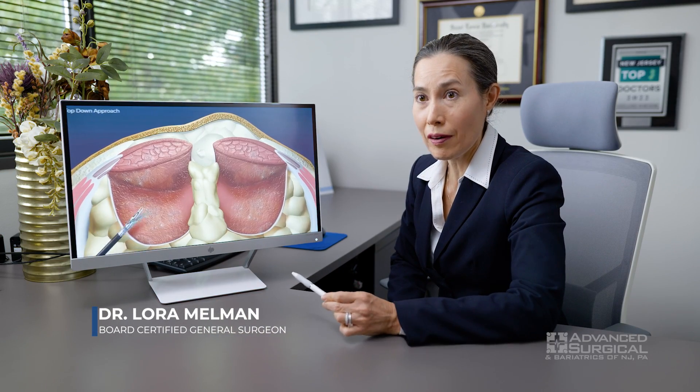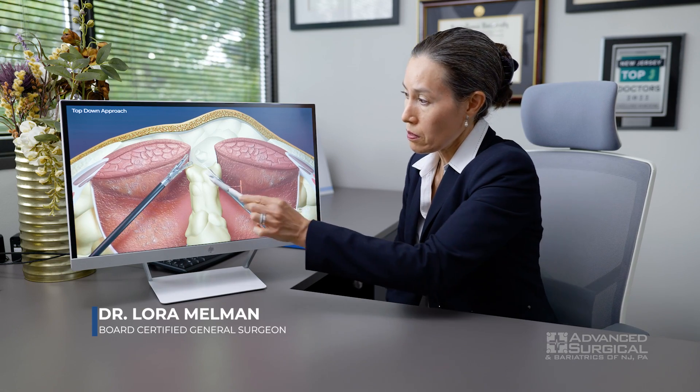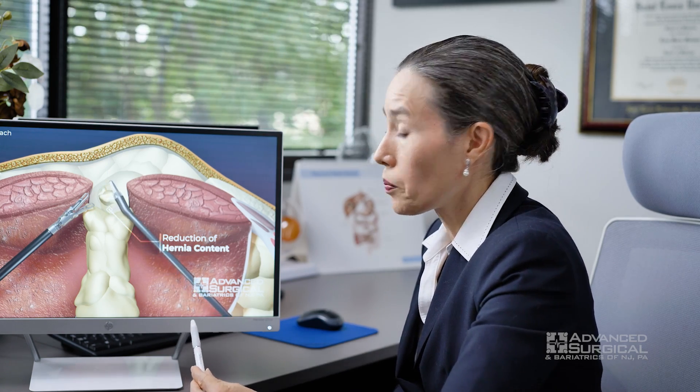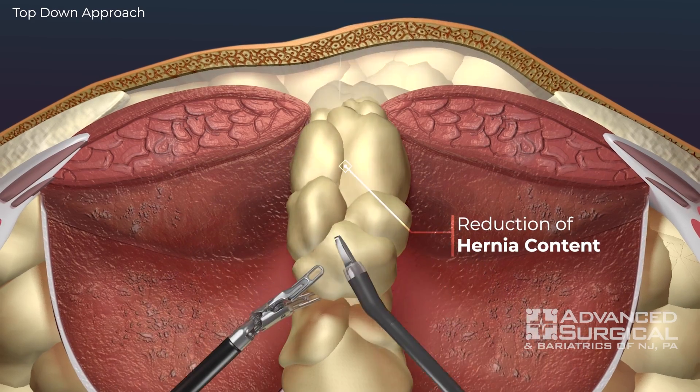This is how we're going to do your hernia repair. We're going to put small incisions in and use small instruments with the robotic technique. You'll be under general anesthesia for the whole thing — it takes about three to four hours in most cases.